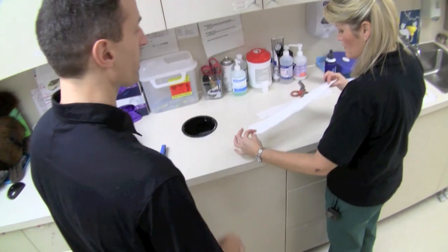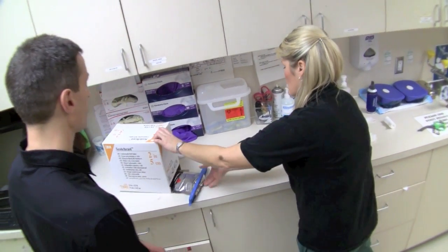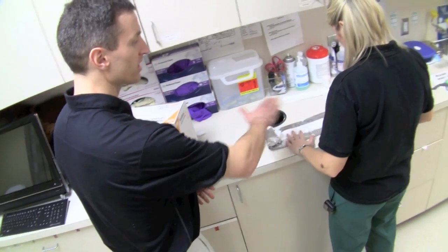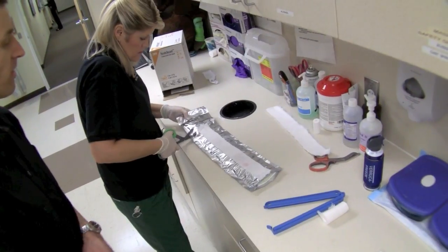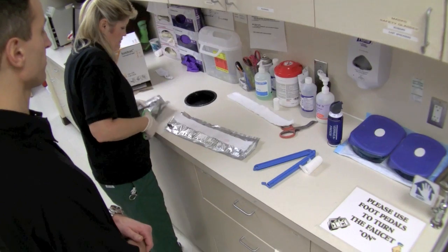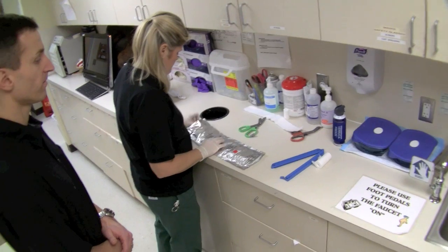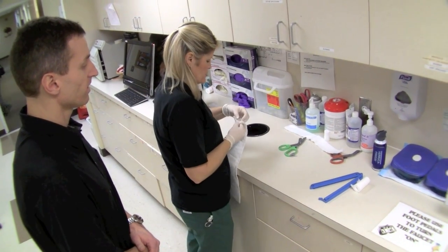Starting out, we've got our padding and our fiberglass. It's simple — you lay your measurement right on top of the fiberglass. Trimming the edges again — there we go.